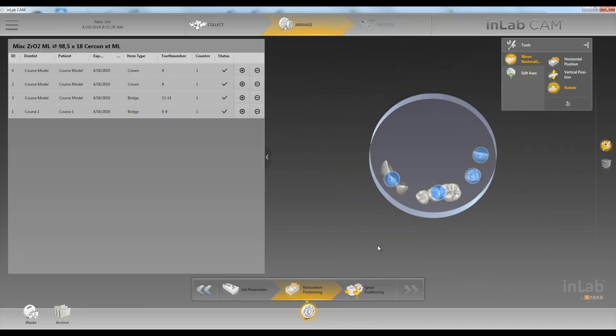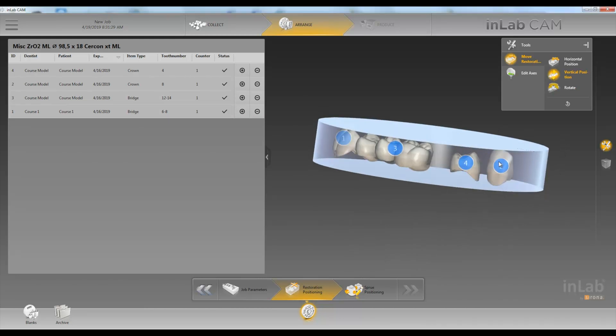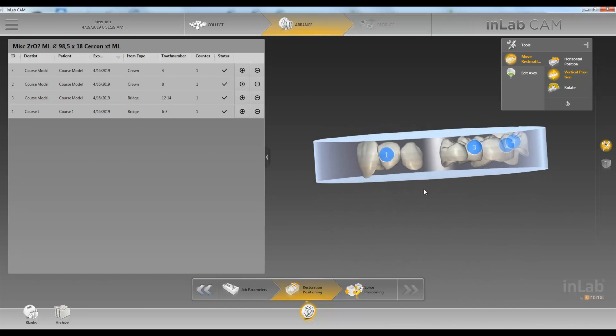We can do the same for this bridge, and we'll lift it up towards the top of the disc. Looks good.